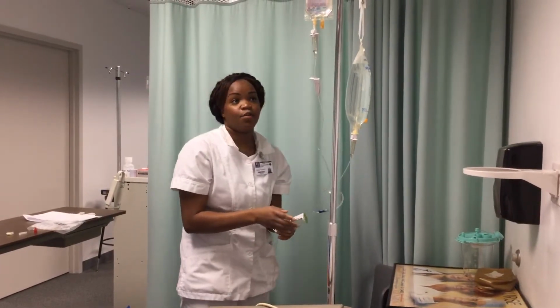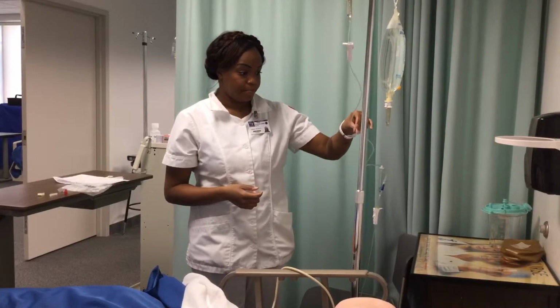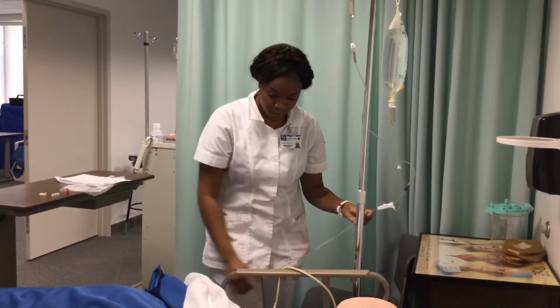It is set. I have it going at 13 drops every 30 seconds, which will be about 25 drops per minute. Even though the total is 25, you have to kind of round because it's hard to get right at 25 drops a minute. So everything's fine, it's running smoothly.